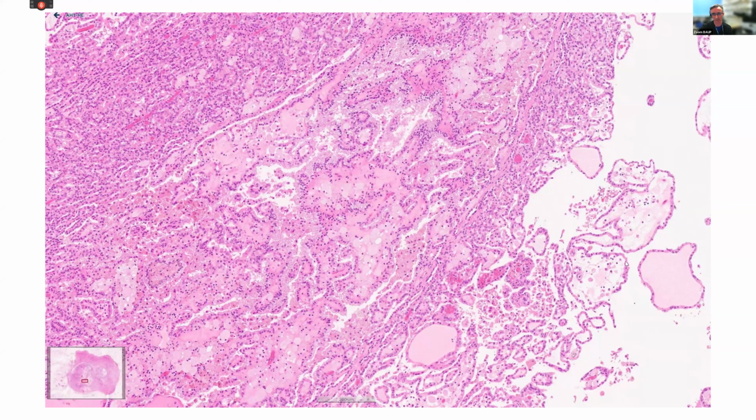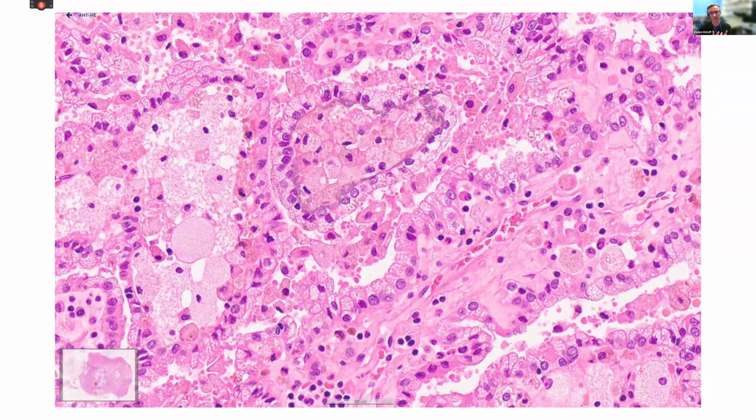thin microcystic areas. And when we look slightly higher power, most of the cells had a light eosinophilic cytoplasm, quite reticular in places. All the nuclei were at the base of the cell, near the basement membrane, not at the apical, not at the luminal border, I should say. And that will be important because there's a couple of answers, I should say, which need addressing. But morphologically, it would do very well for a papillary RCC.